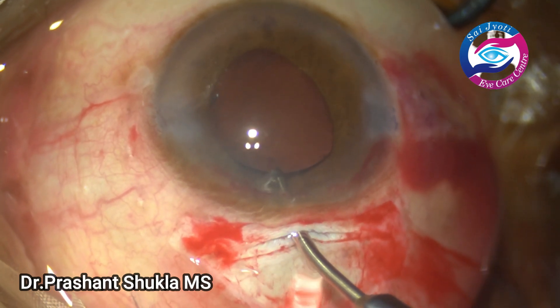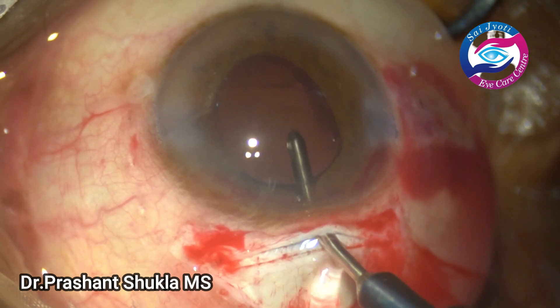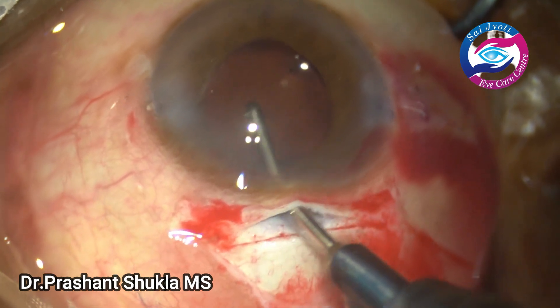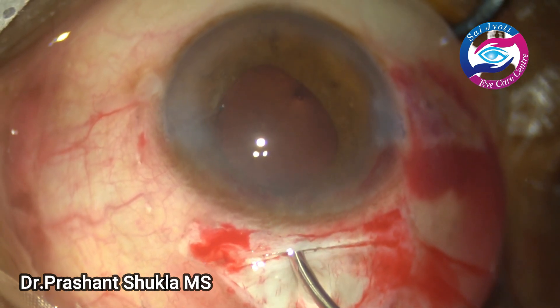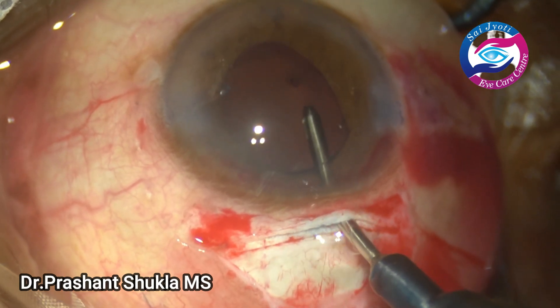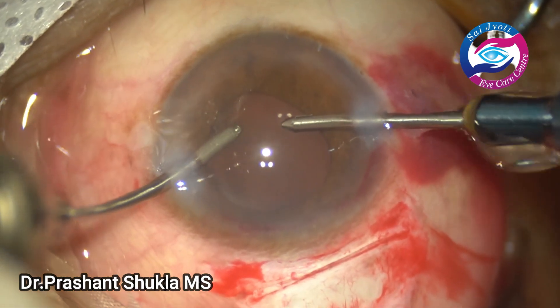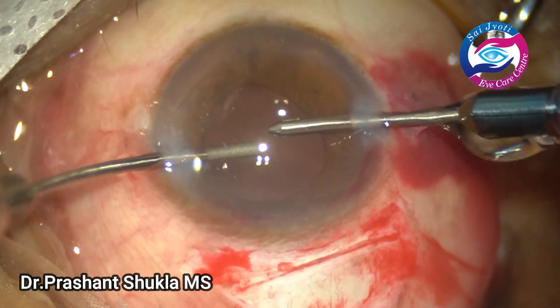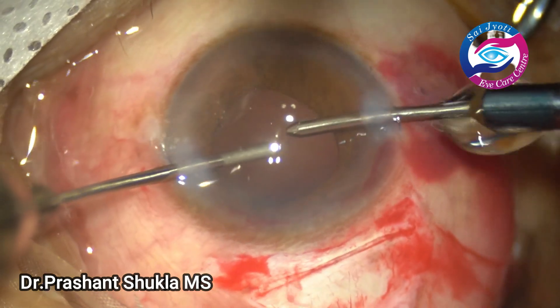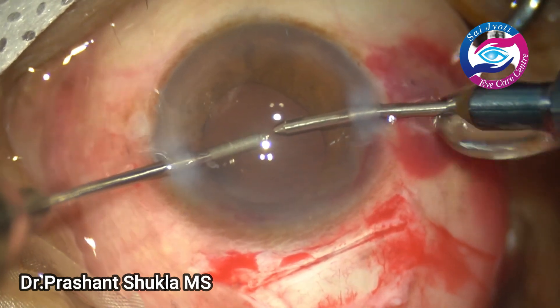Now is the time to remove the viscoelastic by irrigating. The posterior lip is gradually pressed and the irrigation handpiece goes behind the intraocular lens to flush out residual viscoelastic. The upper lip is lifted and visco in the anterior chamber is removed. The remaining viscoelastic is then removed using bimanual irrigation and aspiration with a vacuum of about 450 and bottle height about 110. This is a venturi-based machine which controls the aspiration flow rate automatically.